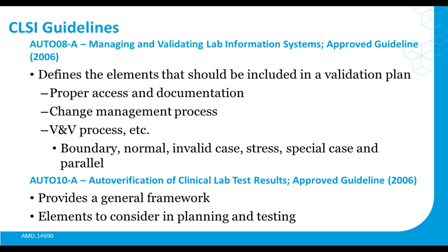So I promised I'd talk a little bit about some of the CLSI guidelines. Don't fault me, the last time these were updated was about 15 years ago, but in reviewing them, they're still very, very much on point for setting the stage for not only managing the validation framework, but also giving you insights as a new user about which frameworks you consider in planning the testing process.